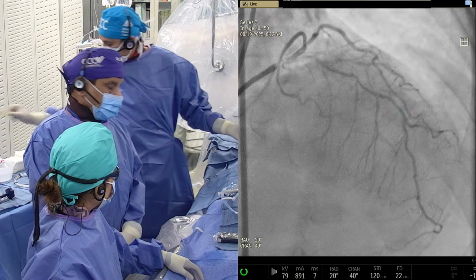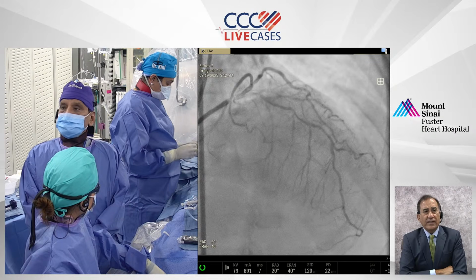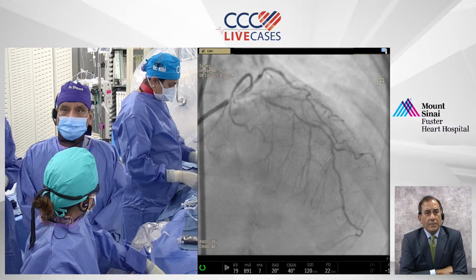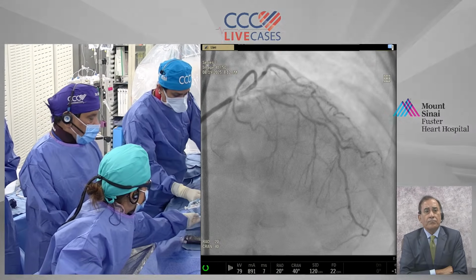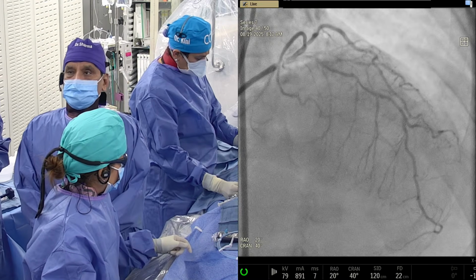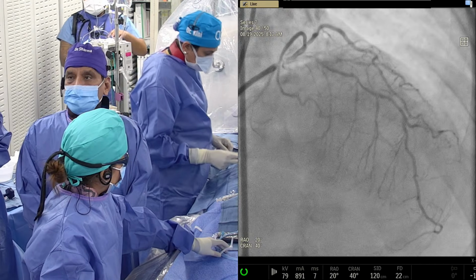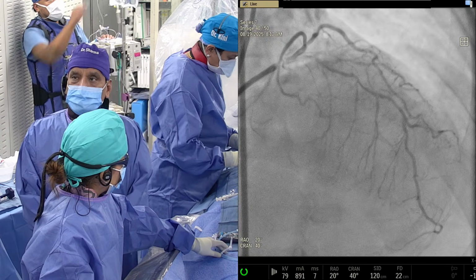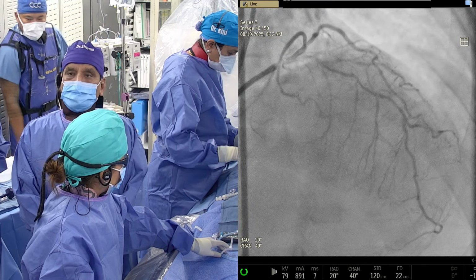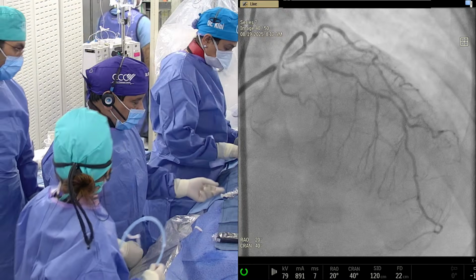Yeah. In a young patient, 44, I think Dr. Jha's point becomes more valid for a geographic region such as India. Yeah, that's true. That's absolutely correct. Yes. So since it's a long lesion, it has a high chance of restenosis, but knowing that we are not going to affect that D3, that's where the lima will be. So as long as we are before that, we will not jeopardize this patient's future chances of very good bypass surgery, be it robotic or mid-cab.